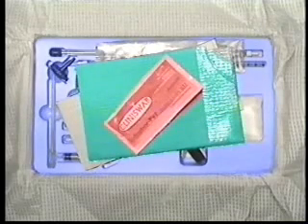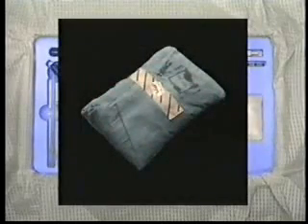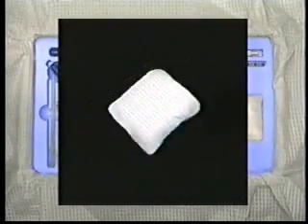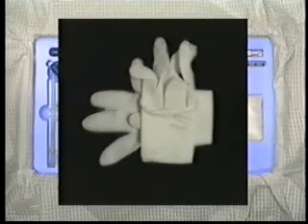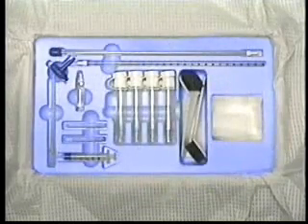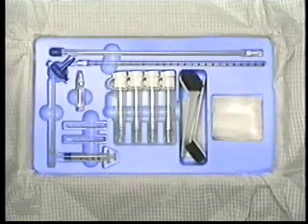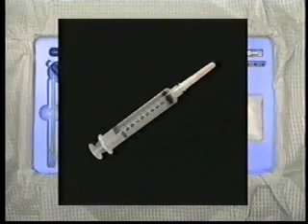Unless you are familiar with the kit contents, you should also obtain sterile towels, extra gauze packages, extra betadine swabs, at least 1 extra package of gloves in case contamination occurs. Kits contain at least 4 sterile vials, but at times you may need extras. Consider an extra syringe and 18-gauge needle.